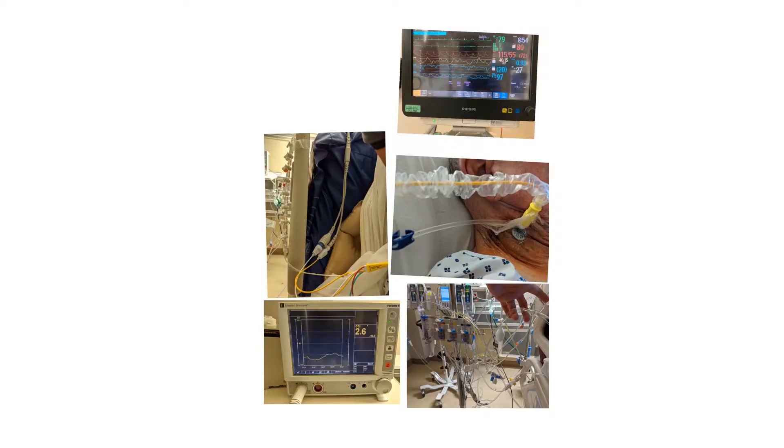Let's demonstrate what we're talking about. First of all, there is an excellent video on YouTube from the New England Journal of Medicine about Swan-Ganz catheters — the indications, contraindications, the catheter itself, the ports, and the procedure — so I advise you to watch it. Here we're not going to talk about any of that, nor about troubleshooting, as this is mainly handled by cardiology, cardiac surgeons, and sometimes intensivists.